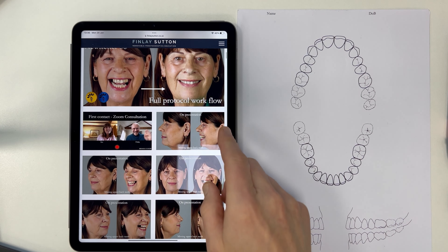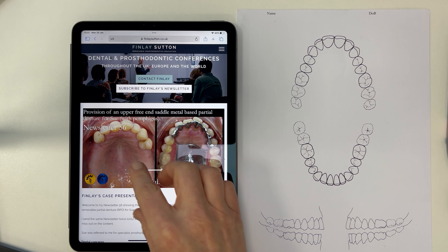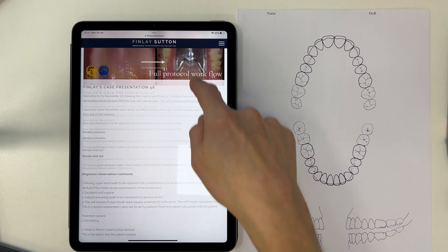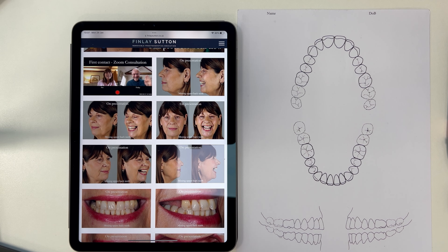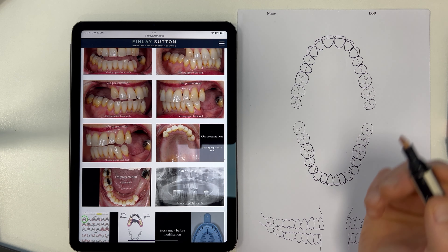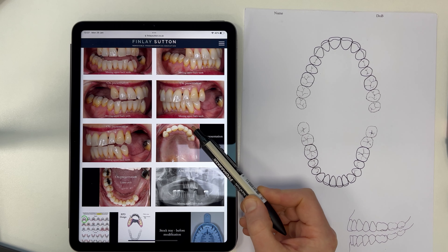I just want to share my design process — how I get from that to that. I want to visualize this before it's actually made, and the best way I find is to design and draw it out. I really like this stage, it's really enjoyable, quite relaxing actually, and it's great having all of these pictures here.